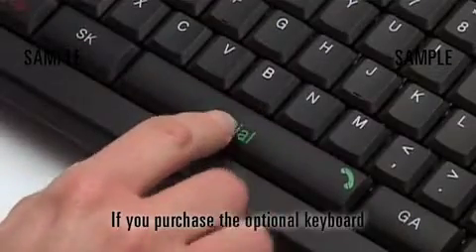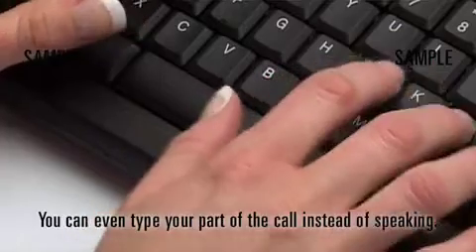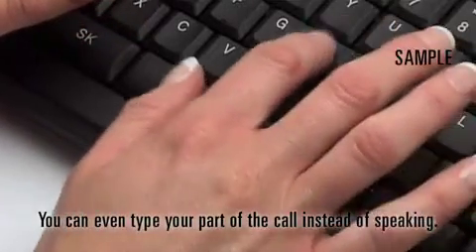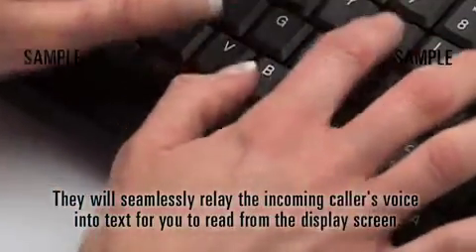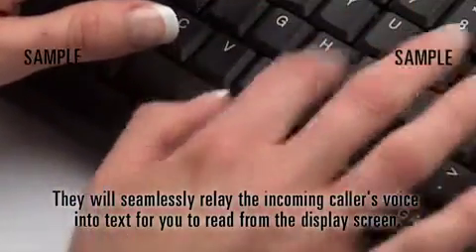If you purchase the optional keyboard, you can even type your part of the call instead of speaking. They will seamlessly relay the incoming caller's voice into text for you to read from the display screen.